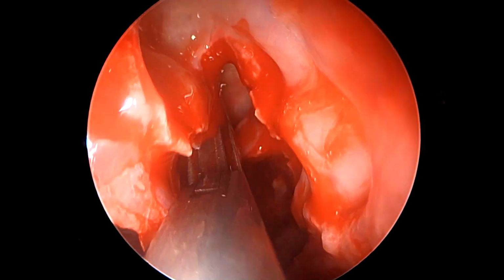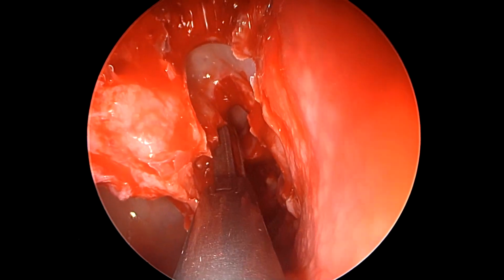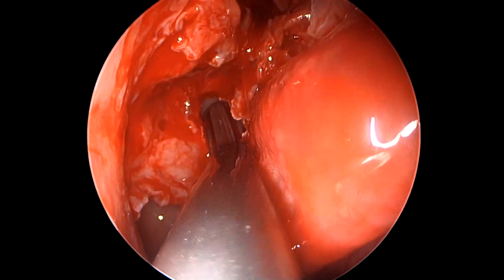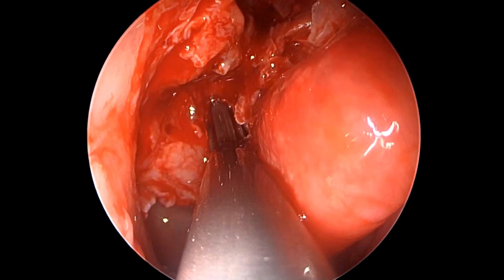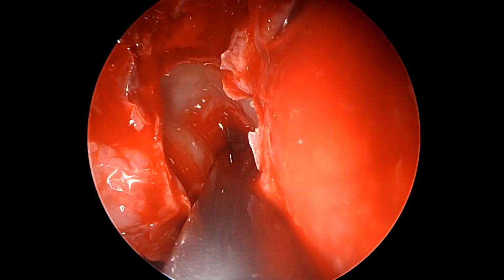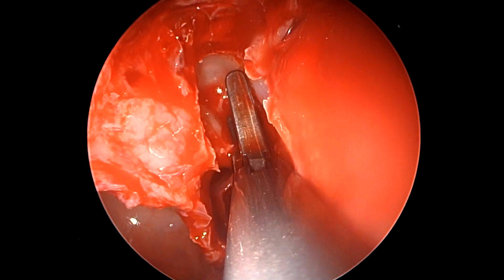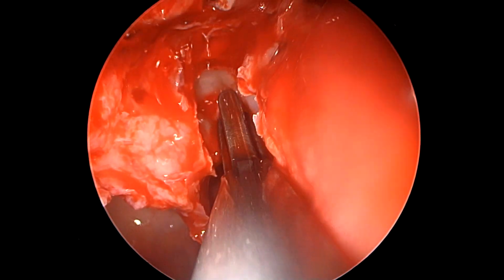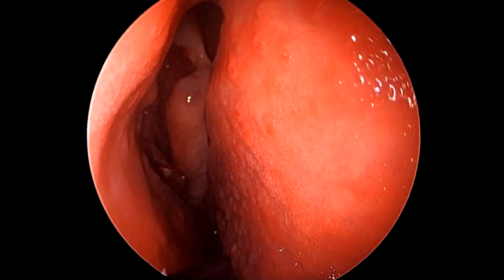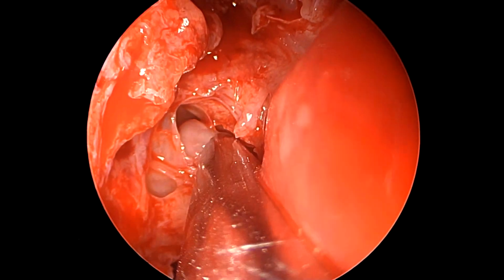because the moment we open the ethmoids comfortably and generously, the patients are able to irrigate, and whether it be polypoidal sinusitis or non-polypoidal sinusitis, it generally helps us in controlling the sinus cavities in these patients post-operatively, and thus maintaining a good vision in the office procedures using endoscopies, as well as preventing chances of recurrences. Leaving septations behind, leaving sharp ledges of bone behind, be it polyposis or non-polypoidal sinusitis, is normally a telltale recipe for failures and disease recurrences.